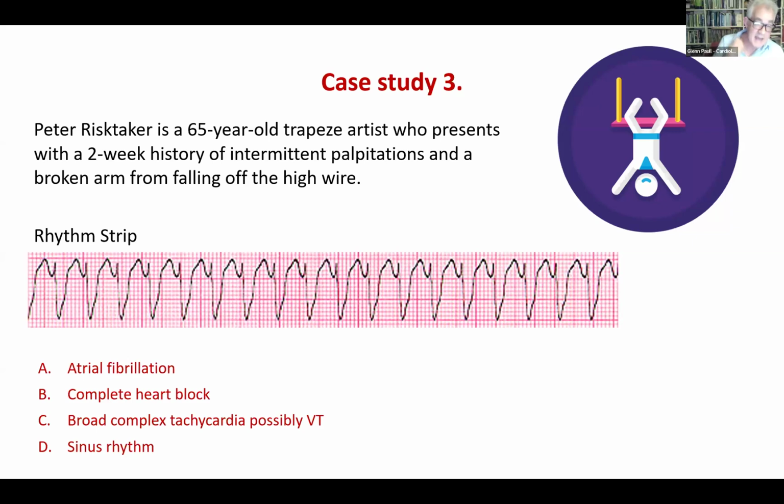Look, sometimes it can be very frustrating. I think going back to the preparation, if you feel as though you've actually prepared the skin well. I think shaving is really important. That's something that can sometimes be problematic. Make sure the skin's clean, good quality electrodes, take your time, make sure the patient's relaxed. They're the key things. Now, every now and again, it's going to be particularly difficult.